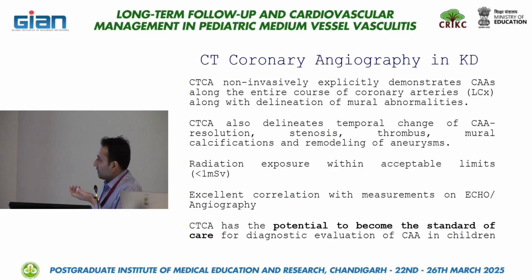What we have shown is that radiation exposure is within acceptable limits, less than 1 millisievert. A chest X-ray is almost 0.1 millisievert, so this is almost 10 X-rays, which is not very high, but in children we are more concerned with radiation exposure. And there is an excellent correlation with measurements on echo and angiography.